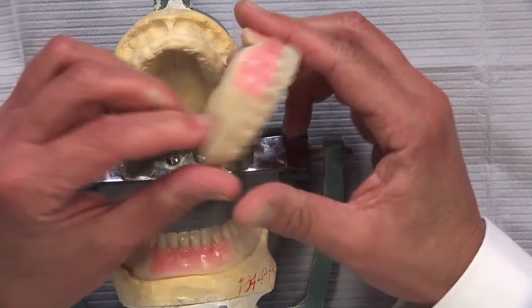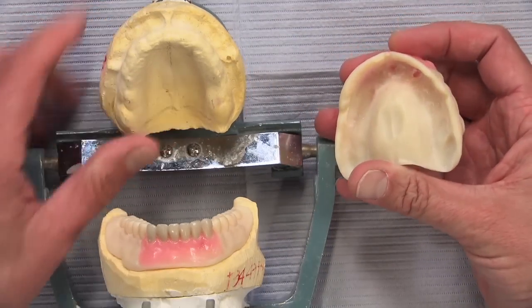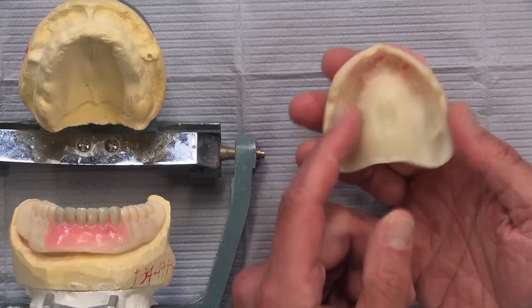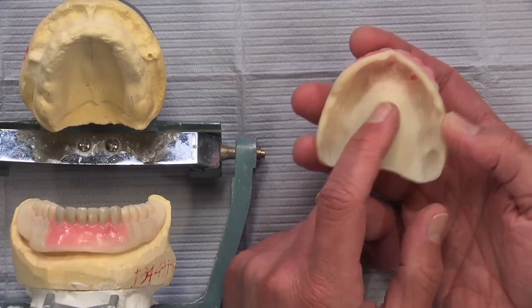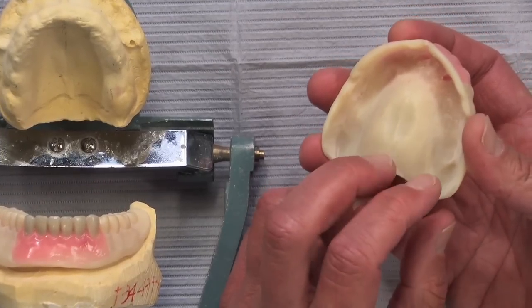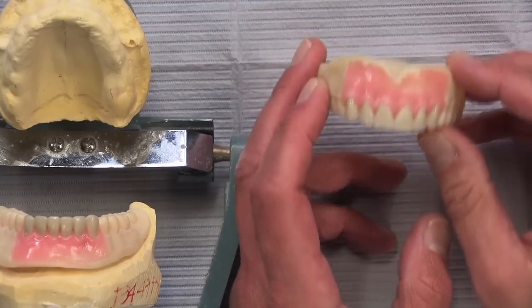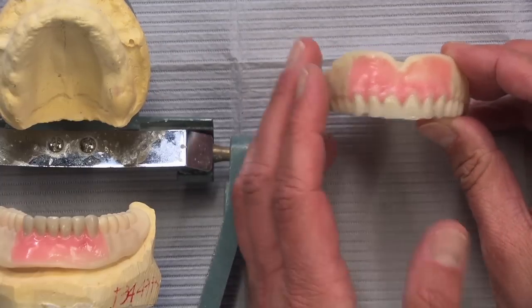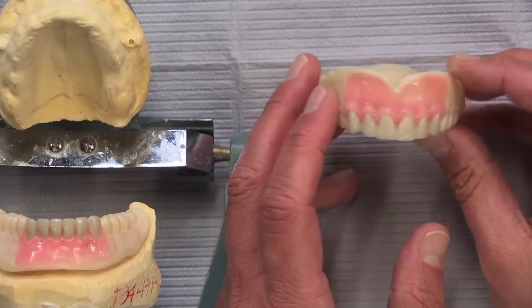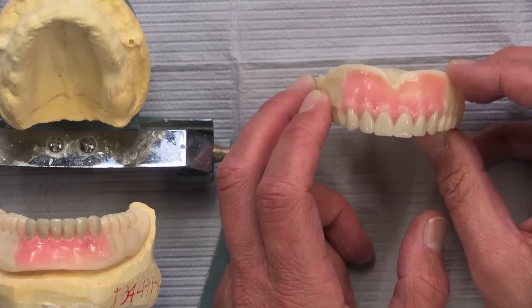When you try this in the patient's mouth, you're going to get that same type of fit. You're going to know instantly, this early in the procedure, whether the impression, scan, and everything is good. If it's a good impression, the patient will have difficulty removing it because of the palatal seal. If it's flopping around, you know you probably need a new impression — maybe you missed something in the post-dam area. This is the fit you're going to get from the final denture.